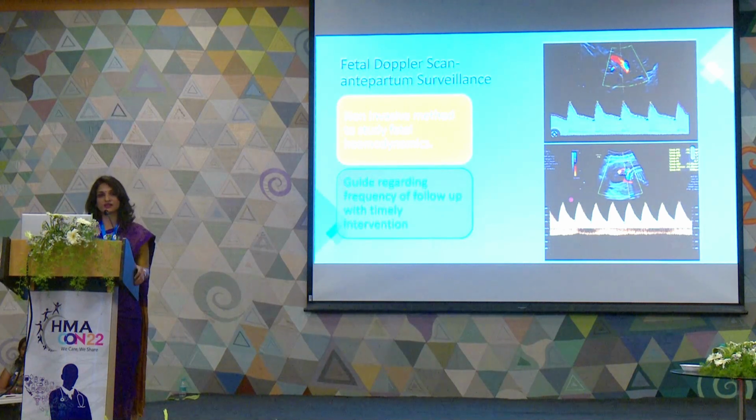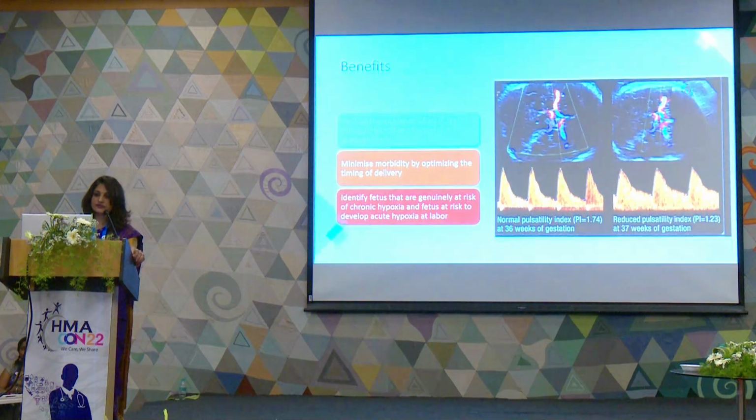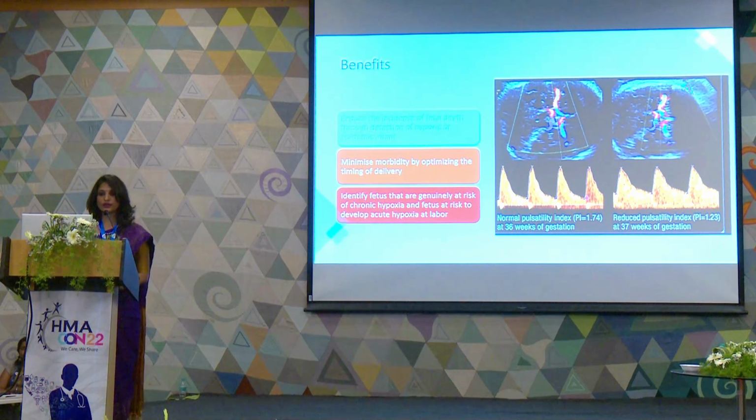Fetal Doppler scan. It is again one of the important scans. It acts as an antepartum surveillance. It is a non-invasive method to study fetal dynamics, fetal hemodynamics, and it gives a guide regarding frequency of follow-up with timely intervention. It has benefits. It obviously reduces the incidence of fetal death by detection of hypoxic and acidemic infants. It also minimizes the morbidity by optimizing the timing of delivery, and it identifies the fetus that are genuinely at risk of chronic hypoxia.